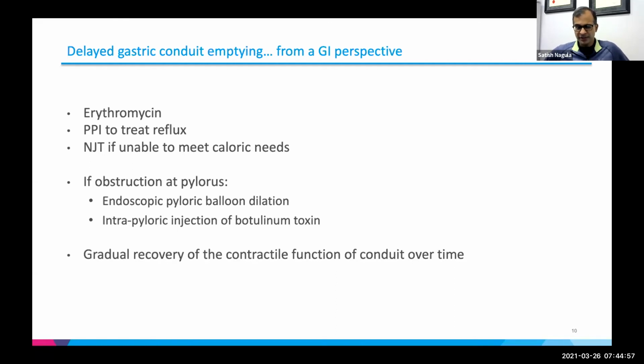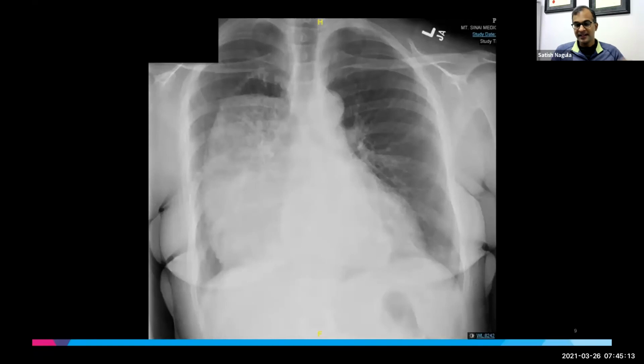It is important to try not to overstretch that conduit. It's a straight shot from the anastomosis down to the pylorus, essentially, when this is done optimally. As in your X-ray, which is really good, that conduit has sort of a J shape to it. And that ends up behaving almost like that little J-shaped pipe under your sink. And there's a lot of stasis in that turn.